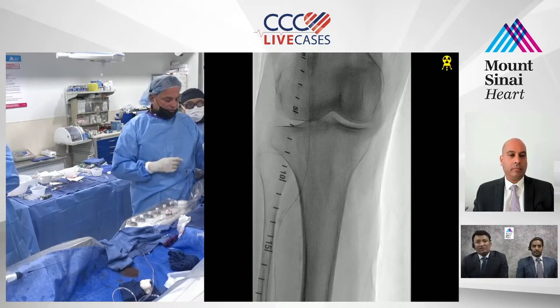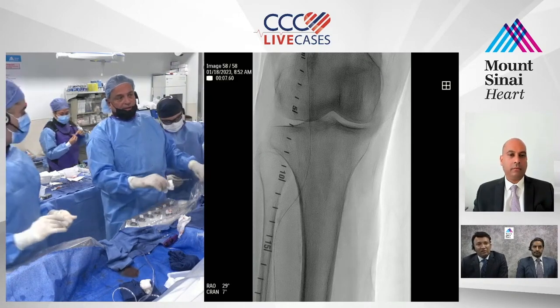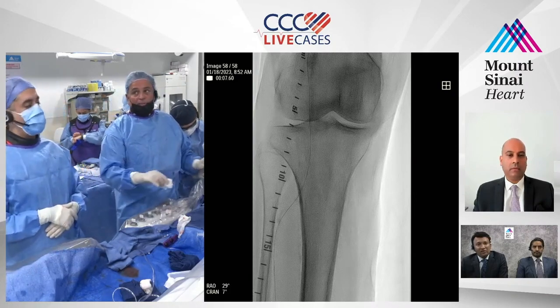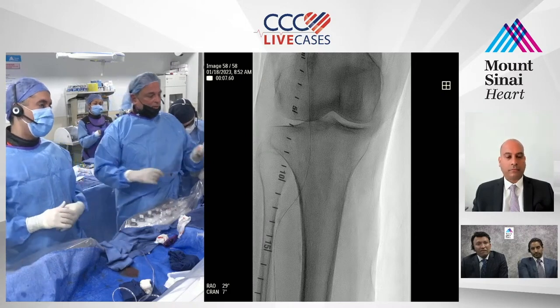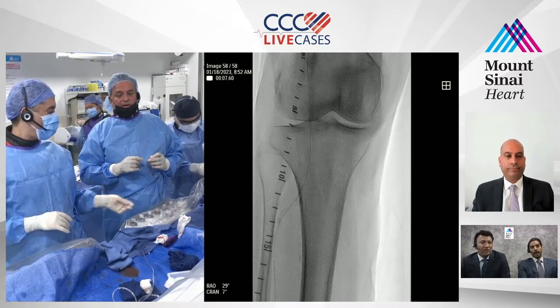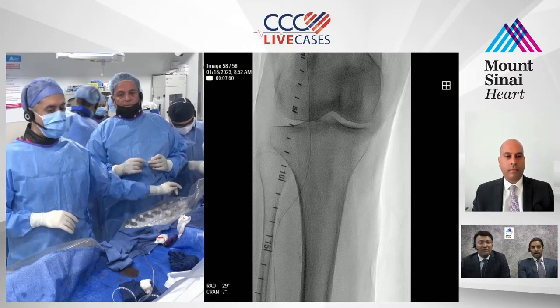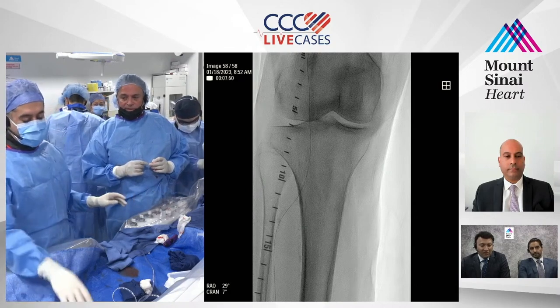I mean, listen. I know PK has the most experience of all for Pioneer. I've never done it through the Outback. I've never done Outback from the foot, so I'm obviously learning. Yeah. The only question here now is whether we quickly stick antegrade, put a wire down, and come from above. I think we should at least get ready with an ultrasound to stick antegrade. Yeah, so I think prep the antegrade access. Well, it's all prepped. Everything is prepped.